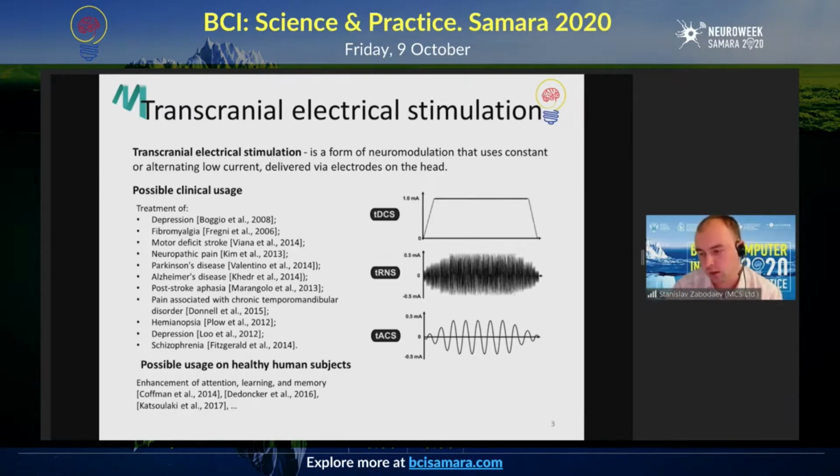Now we get back to electric stimulation. Here we use special electrodes, and you put on the current generator, which keeps this current on by regulating the voltage potential differential between two or several electrodes. And now we modulate neuronal activity of the brain, and we get certain effects. This is what I'm going to tell you about later in greater detail.